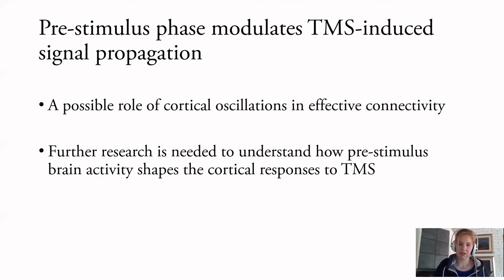Instead, the TMS trials could, for example, be compared with resting state data, so we're sure that we're looking at activity that's evoked by TMS, or use a more reliable method for removing the background oscillatory noise, such as the signal-space projection source-informed reconstruction approach, so SSP-SIR for short.